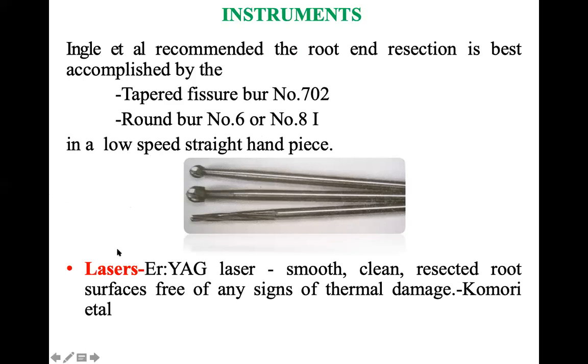At times, if you are equipped with a laser, the erbium YAG laser is used because it is known to give a smooth, clean surface.